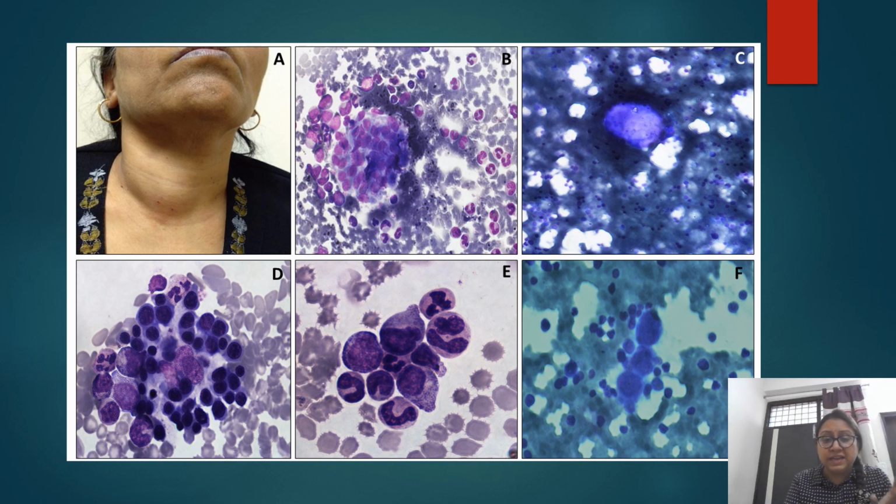But in D, E and F, I am telling you, in D what you see are dark cells, those are your erythroid islands with dark nuclei, and the lighter nuclei which are bigger, those are the myeloid series cells. In E, we can see proper myeloid series cells. You can see neutrophils, myelocytes, and band forms, okay. And this is actually a picture of a particular area, but in the whole smear we saw evidence of myeloid cells, erythroid islands, and in F, we can see these are hypolobated megakaryocytes. So when we get all three elements of hematopoietic cells, we confirm that the diagnosis was EMH.